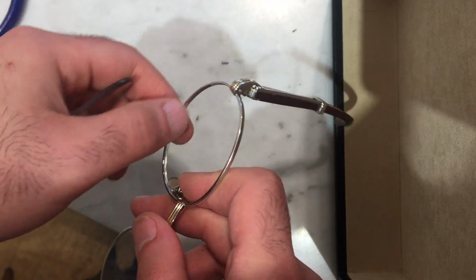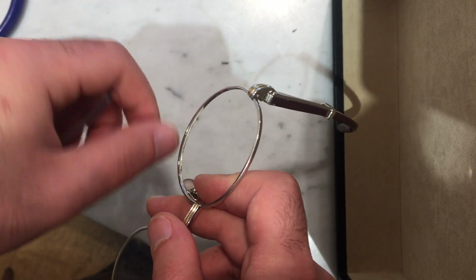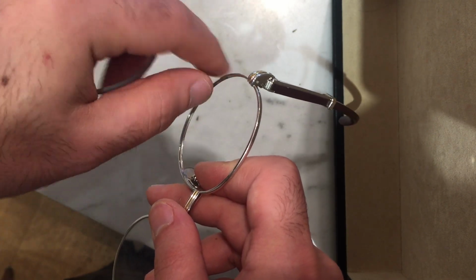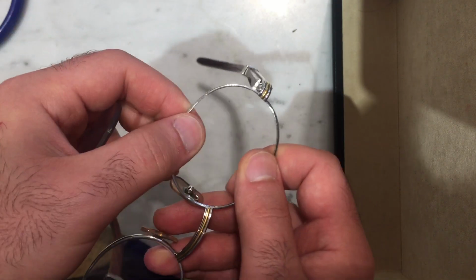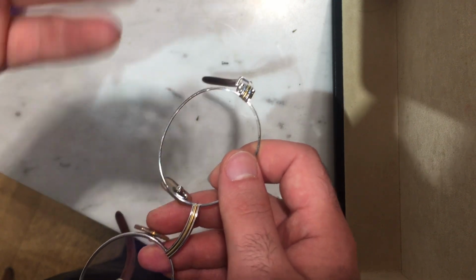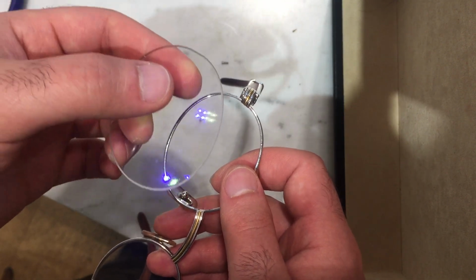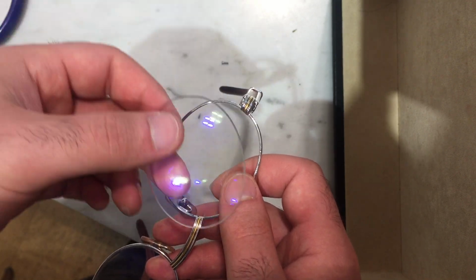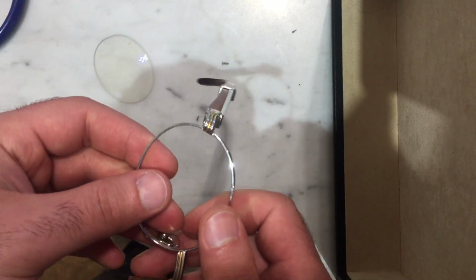It comes in two forms. I think this is the gluish type that you have in like a tube that you just put in there and you let it sit, and then you put the lens back in. It adds an extra layer, and the lens is tighter in there as a result. But let's pretend that we don't have lens liner around. What can you do to get this person out of the door with a pair of glasses that function until they can get it properly repaired?